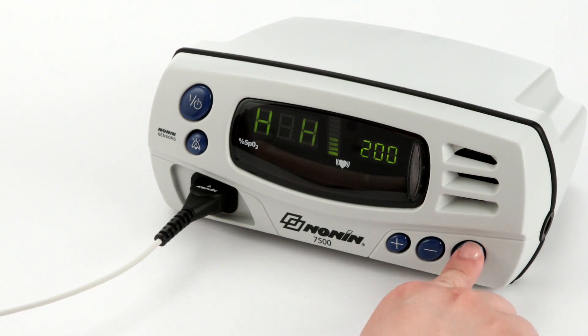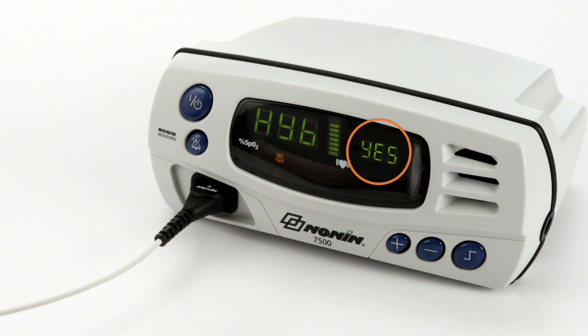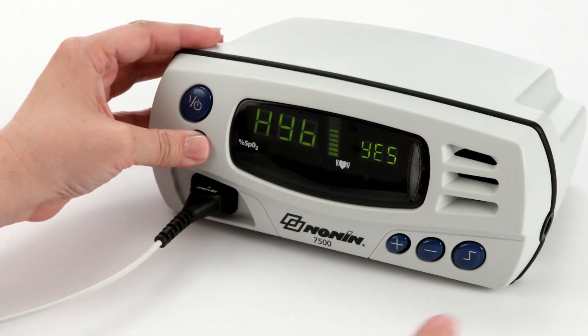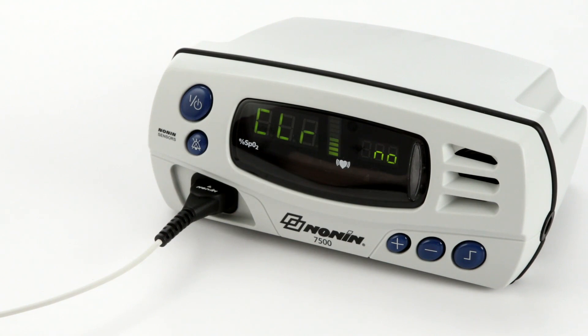To set your 7500 to hybrid averaging, press the limits button until the display reads H-Y-B. Press the plus or minus button until the screen reads yes. Your device is now set to hybrid averaging mode. To save this setting, press and hold the alarm silence button while briefly pressing the limits button. The hybrid averaging mode setting will save for future use. You will not need to reset it each time you turn the device on.